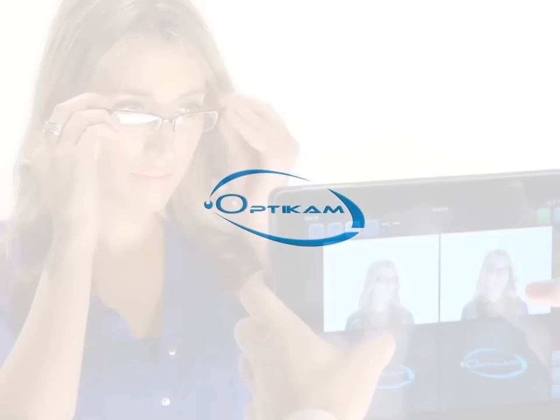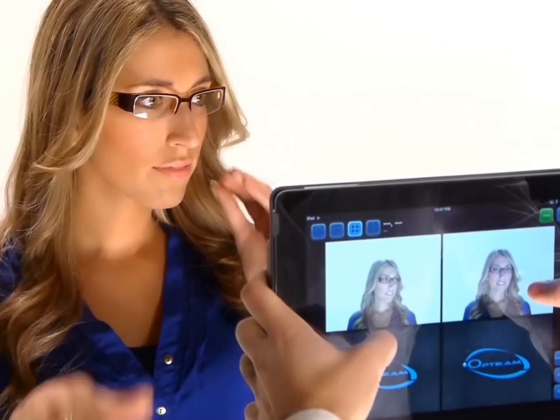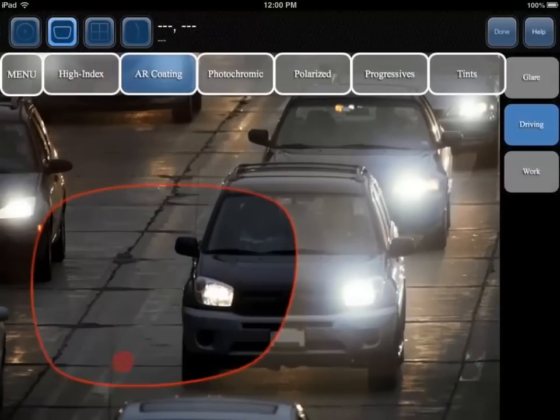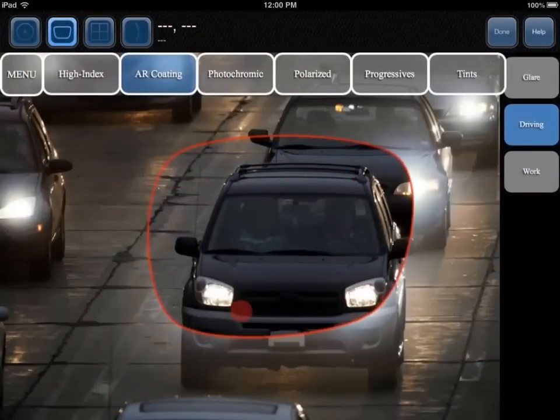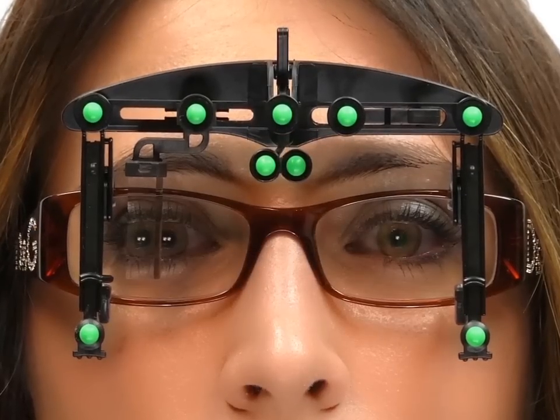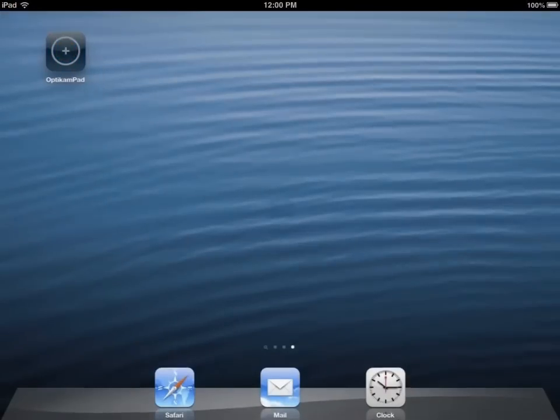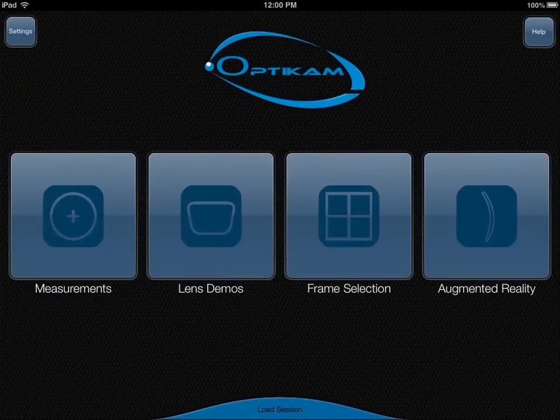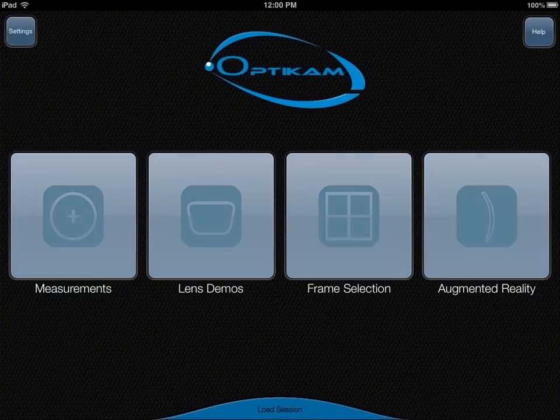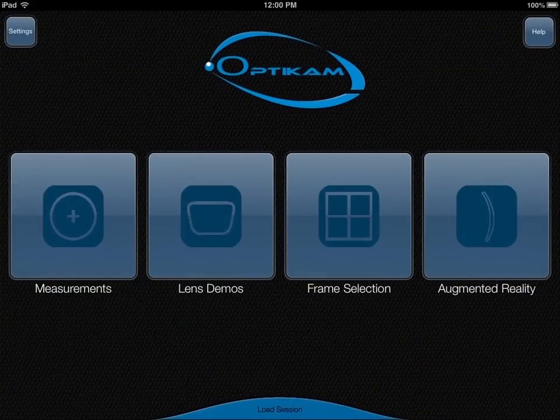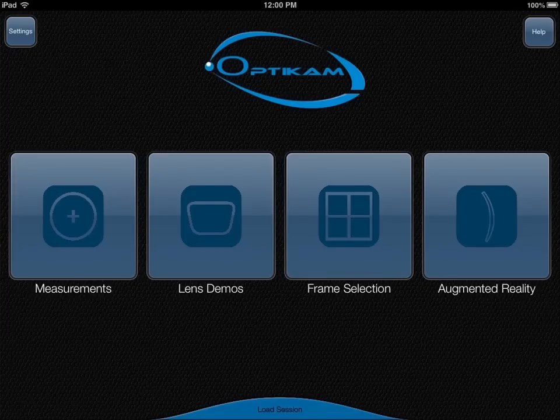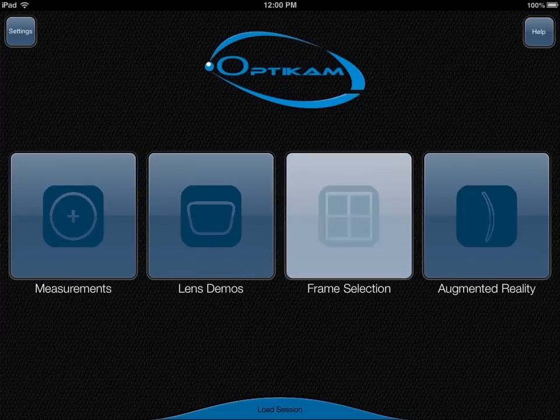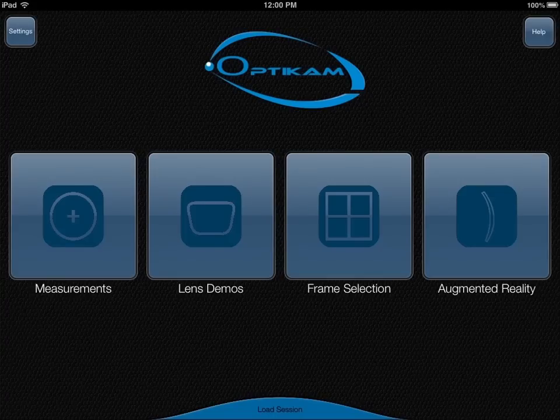The OptiCam Pad is your unique dispensing tool that helps in all aspects of the eyewear dispensing process. When you launch the app, you are presented with icons of all the modules available on your OptiCam Pad software: measurements, lens demos, frame selection, and augmented reality.